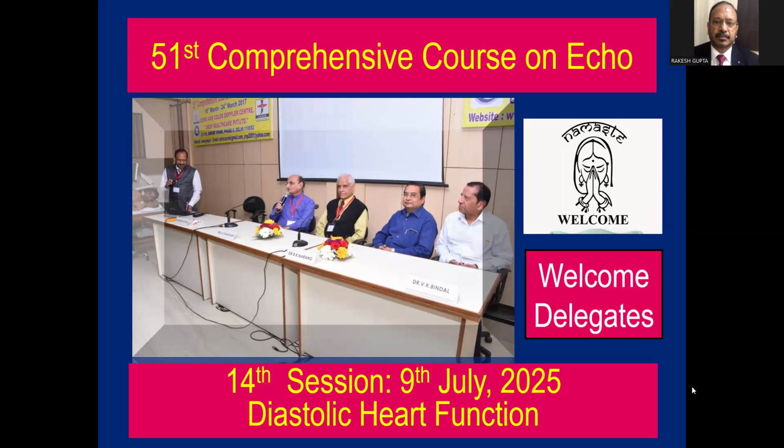We are going to deal with diastolic function evaluation today in this particular session. Before that, let me have some basic revision for wall thickening abnormalities. That is the most important thing. The second important issue is we'll start with the diastolic function after some time, once I'm done with this.